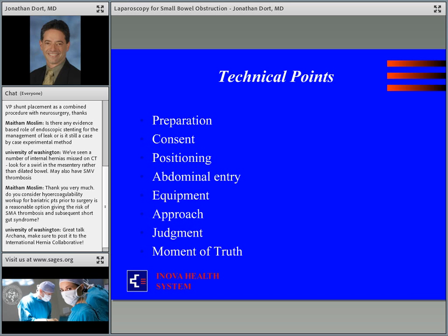Trocars. I will throw myself on the same bandwagon that everybody else did to please beg you to consider open entry in these patients. I'm an open entry enthusiast in all laparoscopic approaches. I personally think that a Veress needle is very similar to what our trauma team has to respond to the ER for a level 1 penetrating injury to the abdomen. But that's a whole separate lecture.